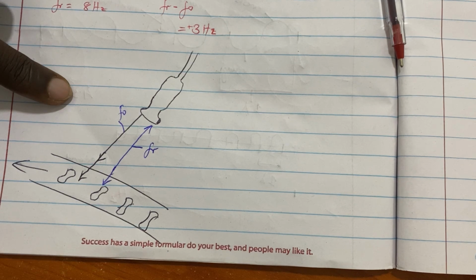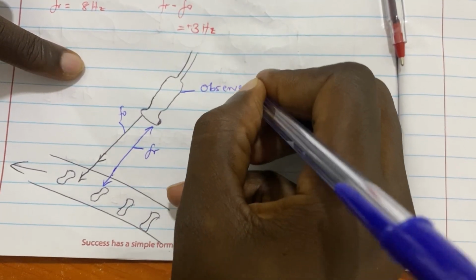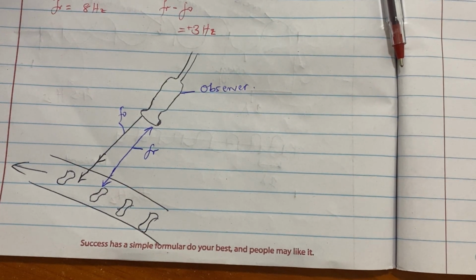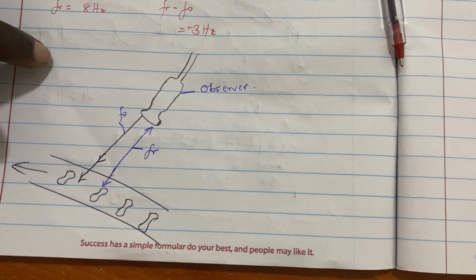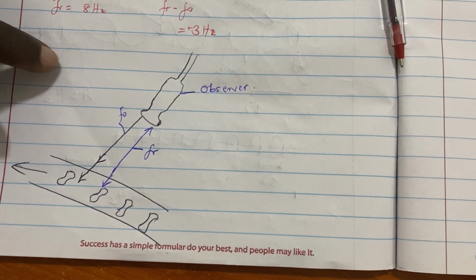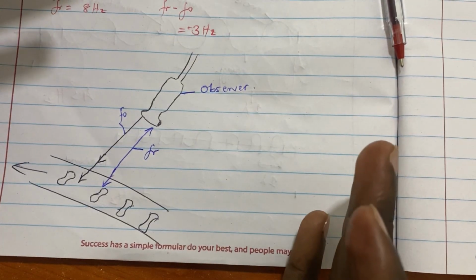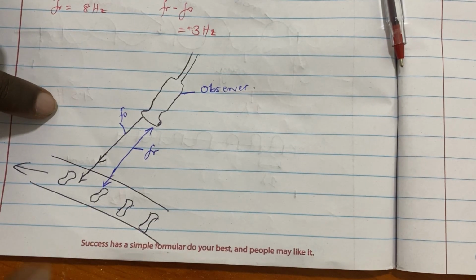So the probe is our observer. It has two functions: to produce ultrasound and also receive the ultrasound. You can call it a transducer. It has a transducer inside. Send and receive, this is a function of the probe. It is our observer. So the observer is sending, at the same time receiving, waiting.